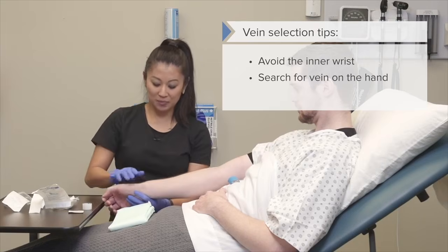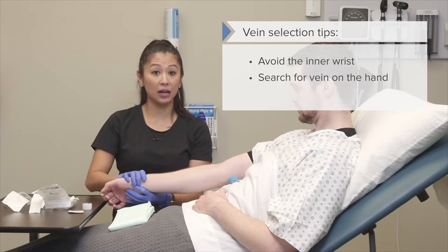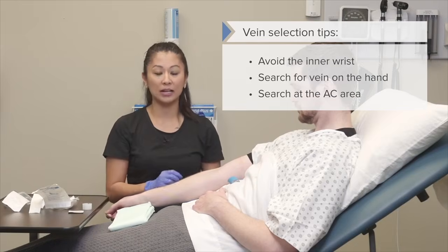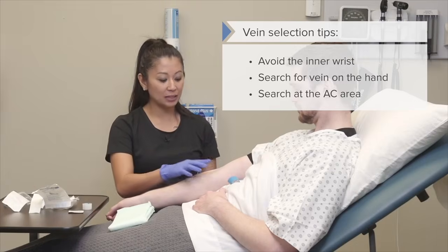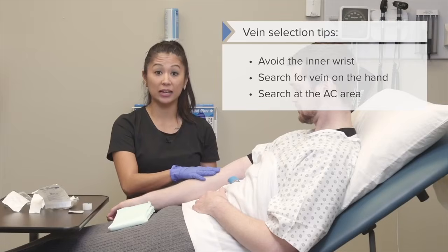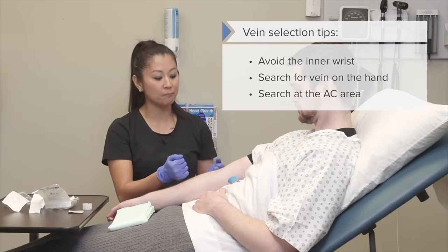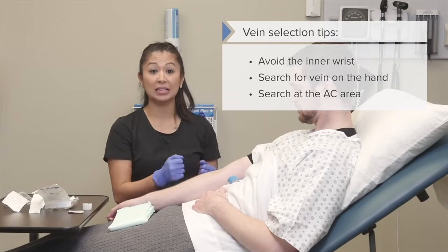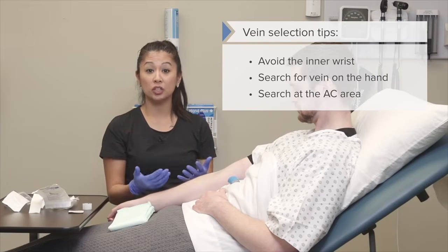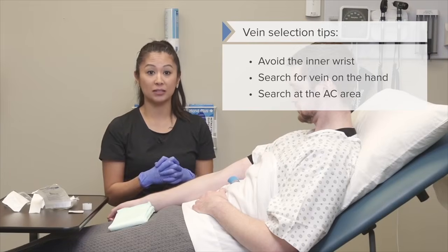There's also some nice ones on the side of the thumb. Also in the AC or antecubital area is a very nice place to go because it's easy to visualize, and usually you have a large vein here and there's typically a pretty easily identified site in the AC area. So as the nurse, you need to choose what's going to be best.